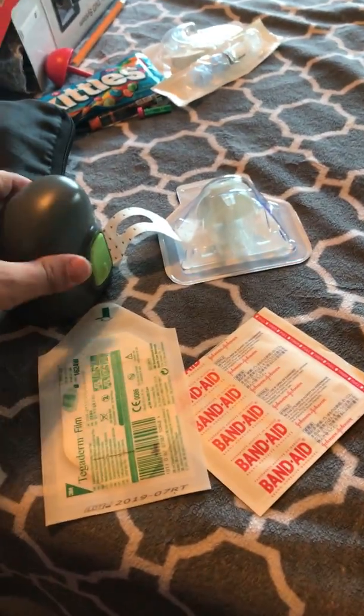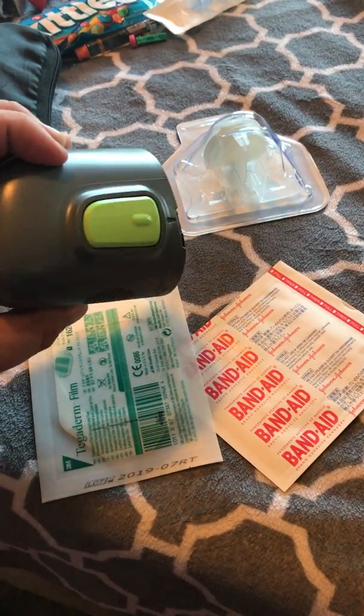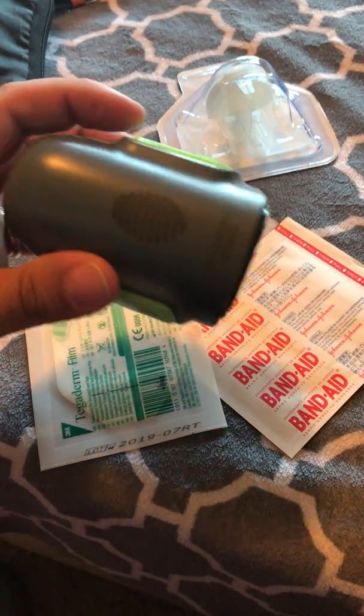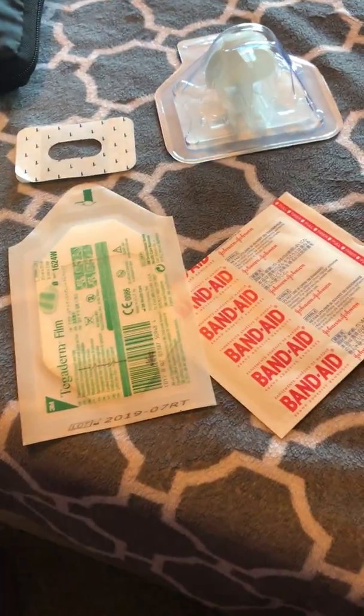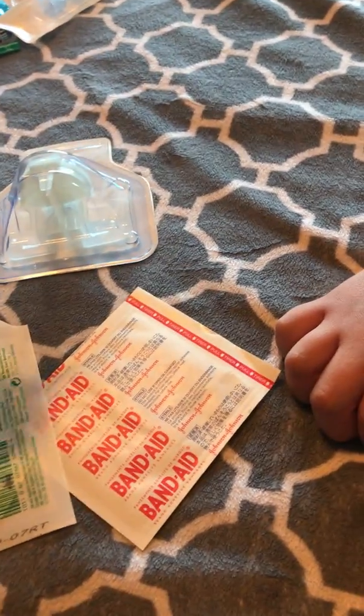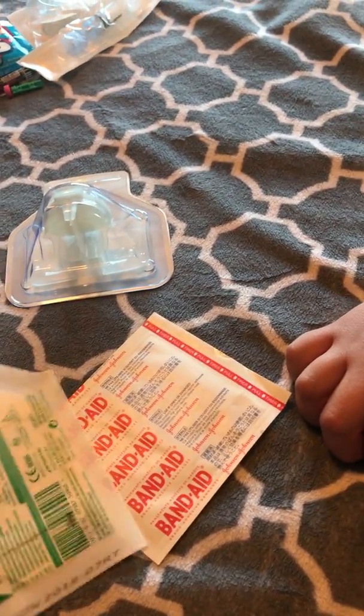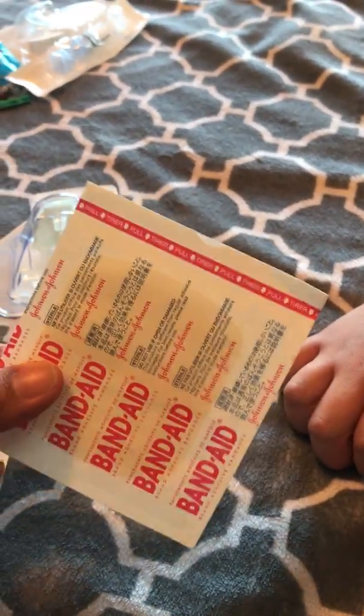All right, to insert Isaac's sensor, you're going to need the following items. You're going to need the inserter. You know you have the right inserter if it has that fingerprint right there. You need the actual sensor piece, one of these adhesives, a Tegaderm, and then the Tough Pad.